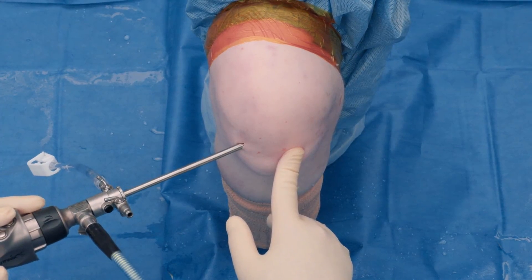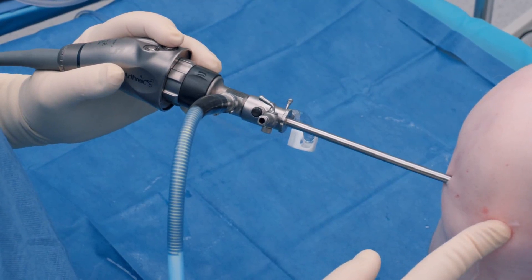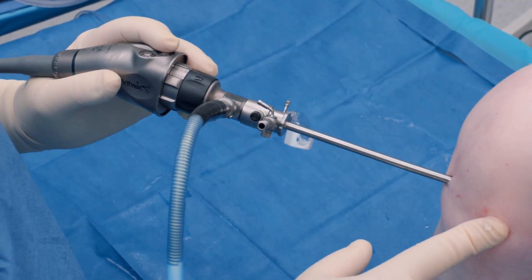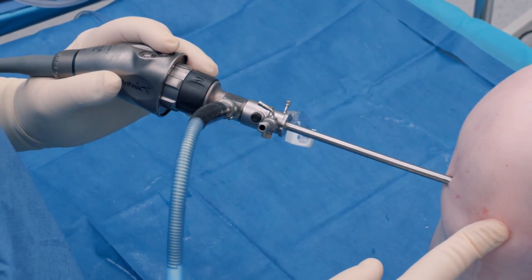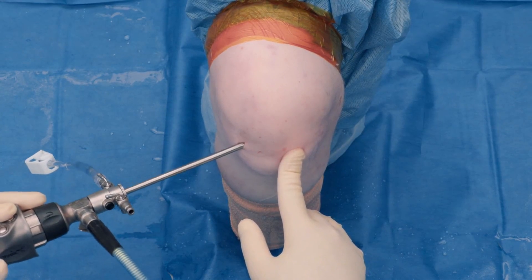This is showing the new Synergy Vision platform with the panoscope. At the touch of a finger, we can move between our typical 30-degree angle of viewing to 70-degree viewing and then to a wide-angle view that gives you sort of a panorama view of the joint.